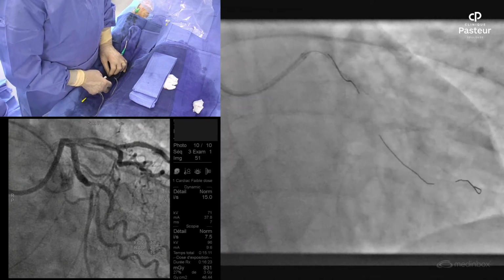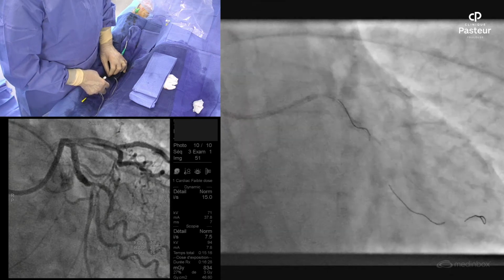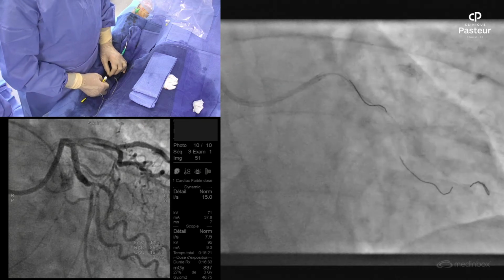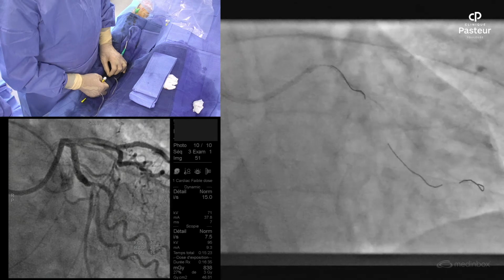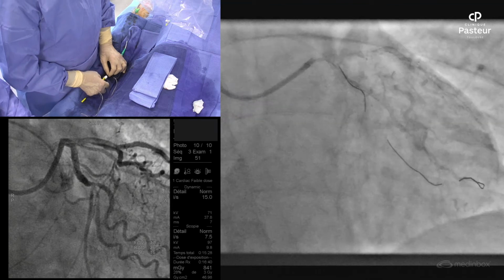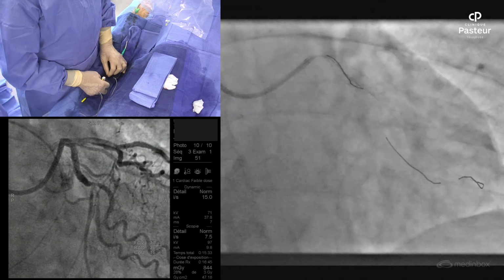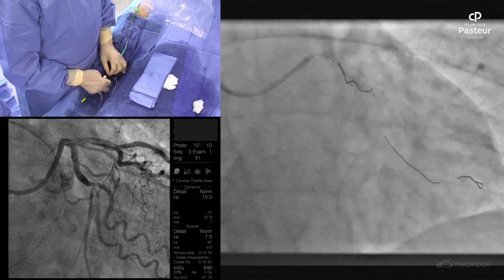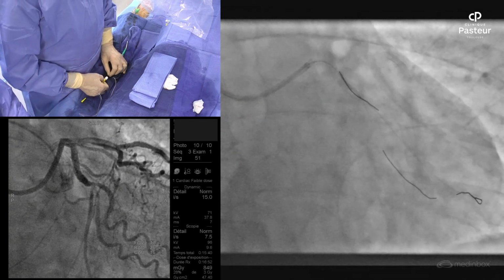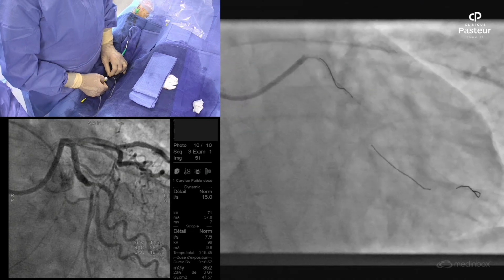In order to take the distal struts, what we try to do is go from distal to proximal. So I take the third one, I redo the maneuver from the first OM: pull back, turn clockwise. Here we are.